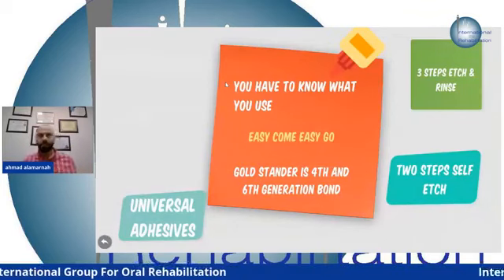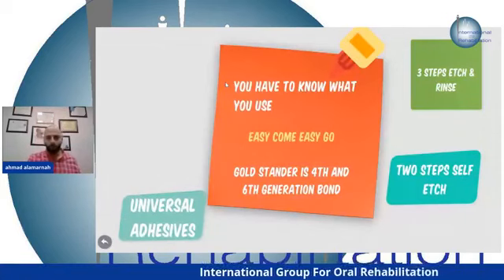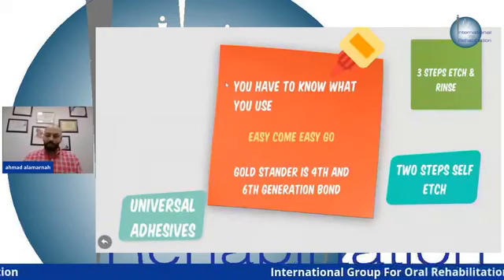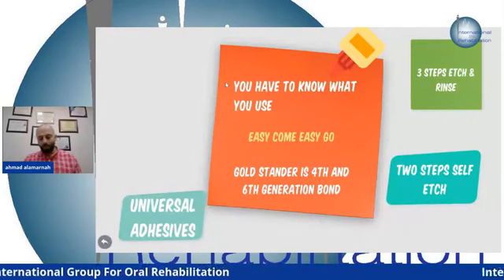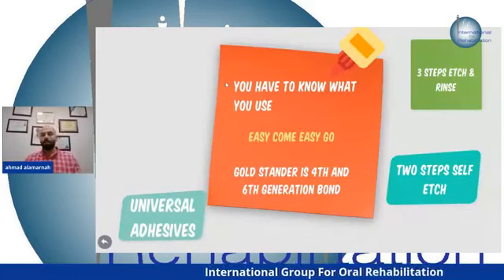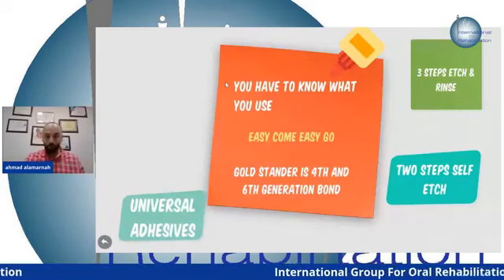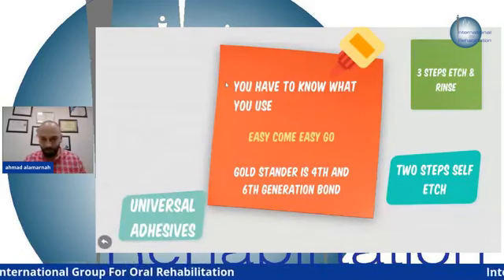And there is a classification depending on the use of acid etching as a separate step or together with the bond. So let's say that there's a gold standard in 2 ways. The gold standard with the traditional way, the etching, rinsing, then priming, then bonding, is the 4th generation bond. It's the most predictable and has the highest success rate. But it takes time and it's technique sensitive. You have to pay attention to every step that you are doing.